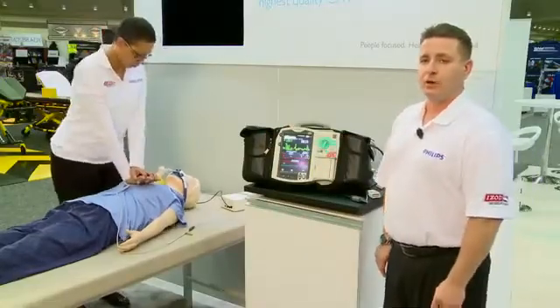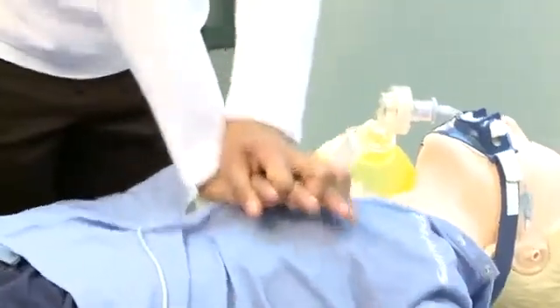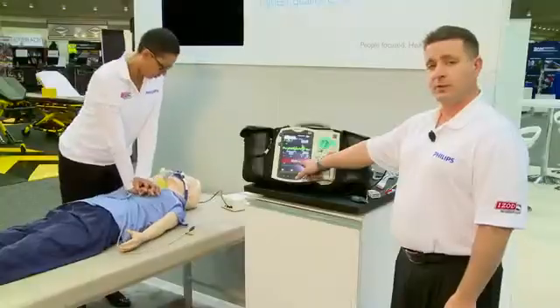We can also encompass delivering high quality CPR with the CPR feedback device, both for the provider doing the CPR and for the rest of the providers in the room by witnessing the quality of CPR on the machine.